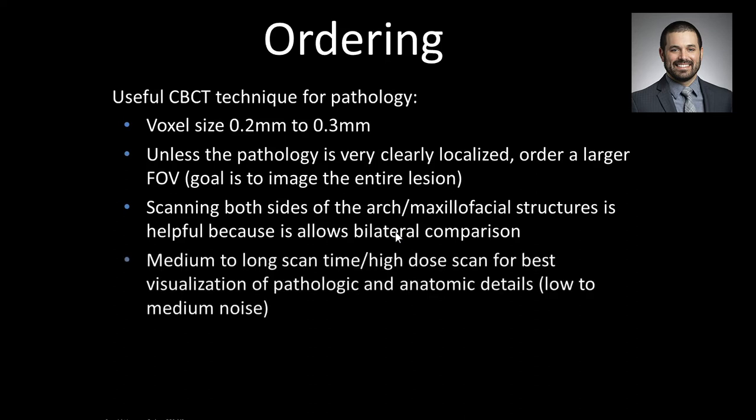We're typically selecting a medium to long scan time to get a higher dose, but the best visualization of those pathologic and anatomic details. You're driving noise levels down. We really don't know what we're going to find, so we're erring on the side of more information is better. In this case, we know something is wrong, so we have clinical indication to investigate more aggressively than, for example, the asymptomatic implant patient or orthodontic patient.